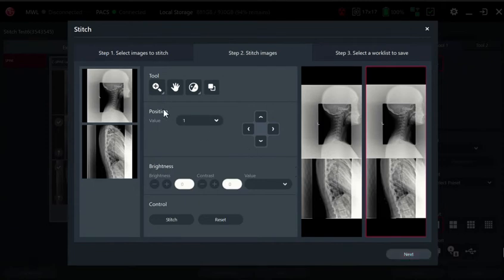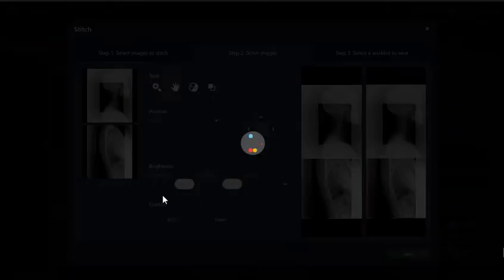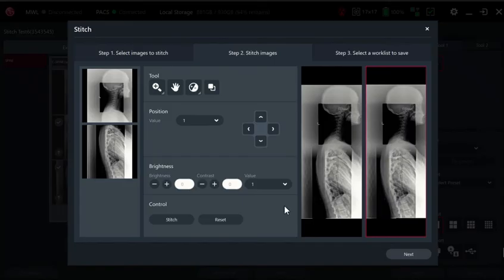You can fine-tune the image here if you want by clicking on the arrows and moving them around, but we won't do that now. You click the stitch button and then you click next.